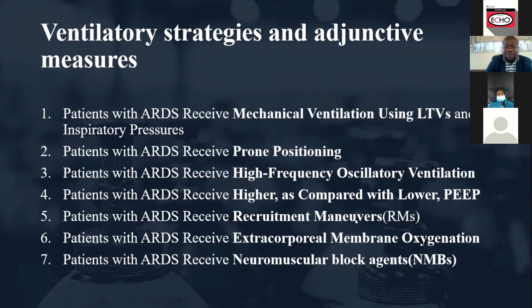As we experienced with our COVID cases, our COVID patients get intubated and put on a machine. Sometimes they are fighting on the machine, and you need to sedate them, and then use neuromuscular blocking agents.